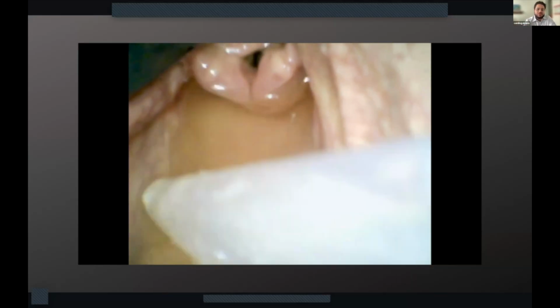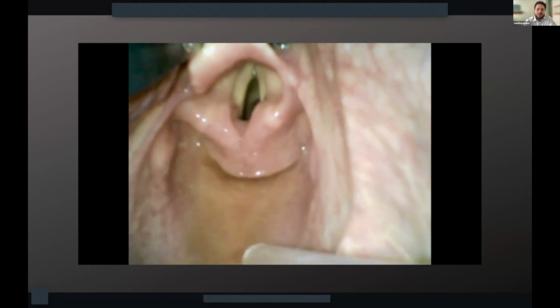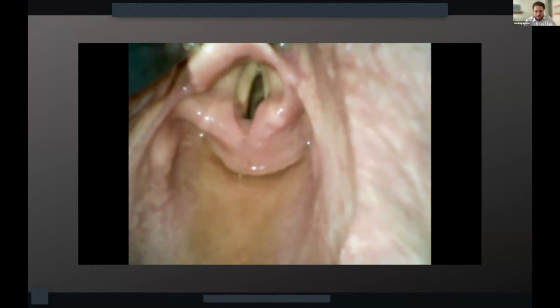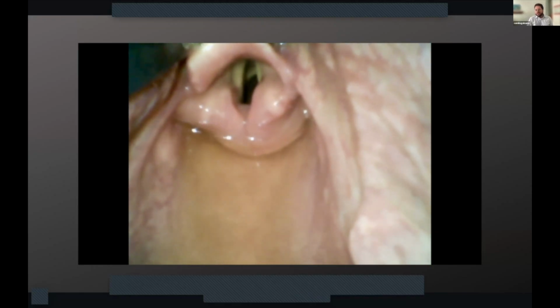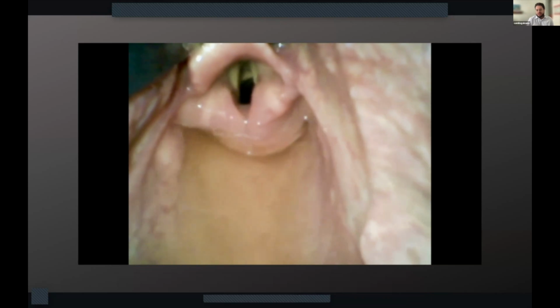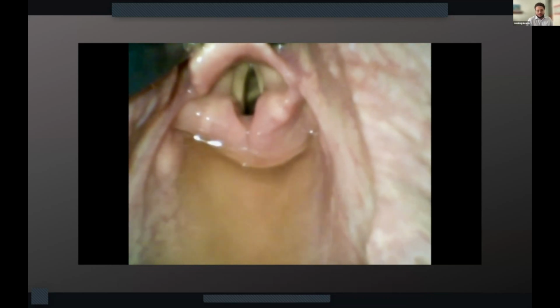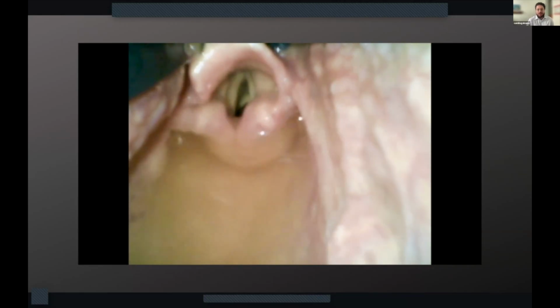And here, we're actually able to see our vocal cords. We suction again because there's a lot of gastric fluid and gastric content coming into view. The one thing that I would do differently, which is part of our SALAD, is I would actually just park that suction catheter in the esophagus, right? As you can see, they suction and they remove the suction, but then some gastric content continues to accumulate. Now, at this point, it's not too bad, and they progress with the intubation.